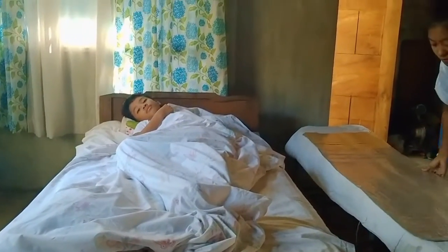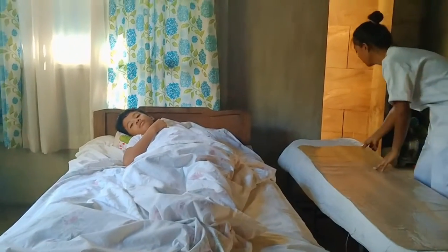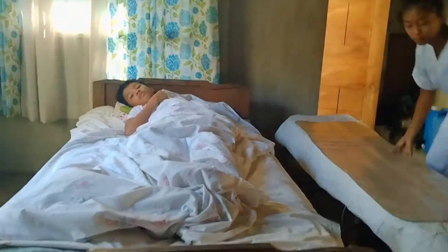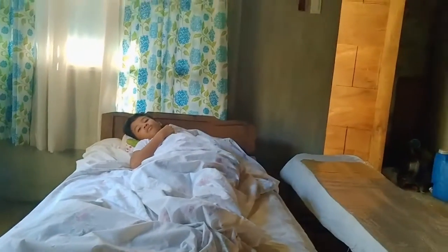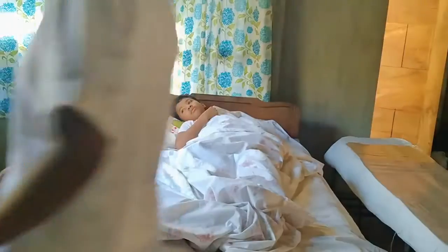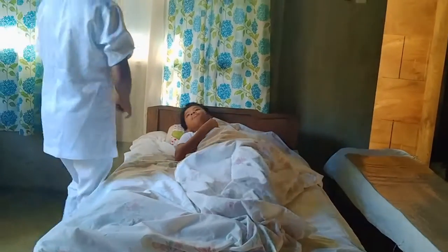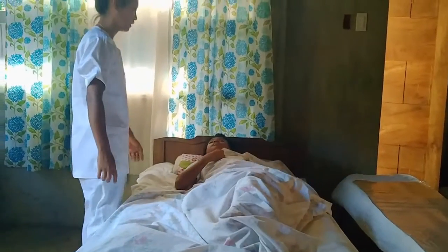In the following demonstration, the term 'assistant' is used to refer to additional staff members required to ensure health worker safety for the move of the patient.